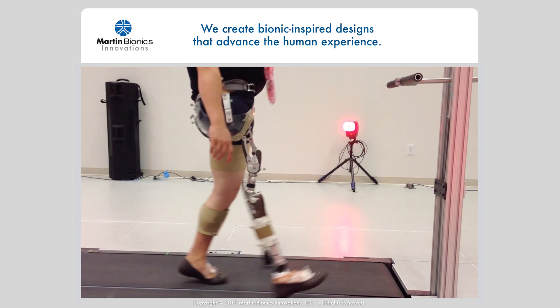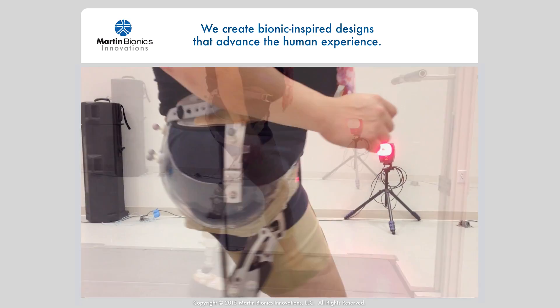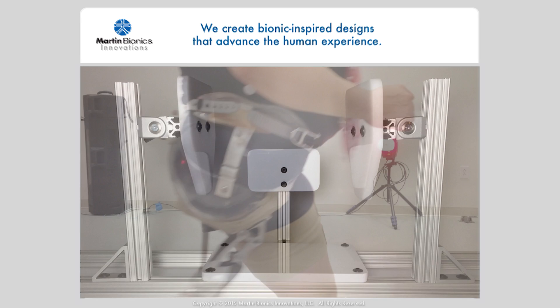One of the fundamental elements of a well-fitting prosthesis is how well it matches to the underlying anatomy of the user, and more specifically, offering a solid biomechanical lock about the body. That's just what we've done.